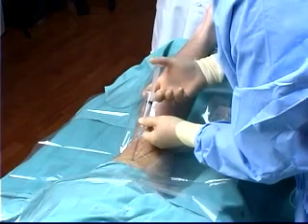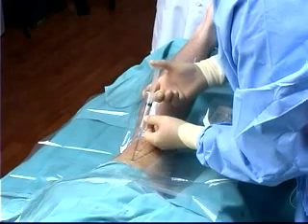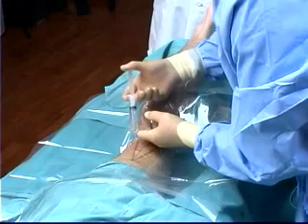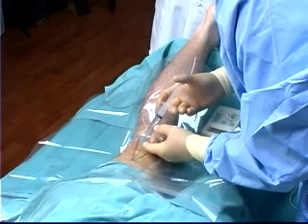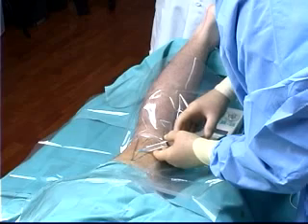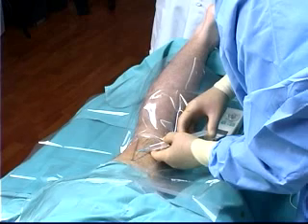The patient is positioned in the prone position with the knee slightly flexed. The tendon of the biceps femoris and the semimembranosus muscles are palpated and marked. These tendons usually meet to form the apex of a triangle, of which the base is the skin crease behind the knee. A line perpendicular to the base line of the triangle is dropped from the apex of the triangle, and needle entry is slightly lateral of this line, 7 to 9 centimeters above the crease.